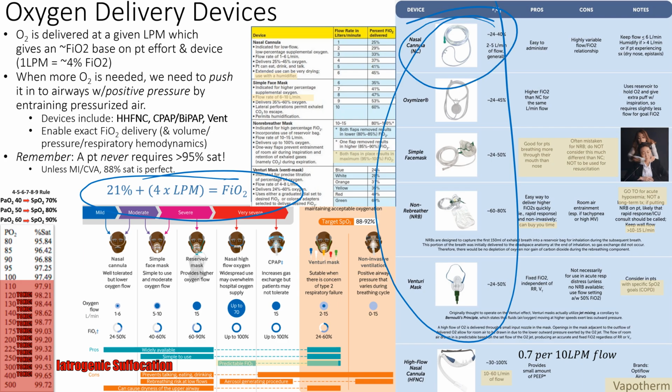Like a cannula, what's the max rate on a cannula? It's max 30 if you crank it all the way up. It's going to start whistling, and it's going to be annoying. You have to provide humidification if you're going to keep it there for any longer than an hour. The max rate is as much as you need, it's just going to whistle. But with a nasal cannula at 6 liters, we're probably going to consider doing something else.